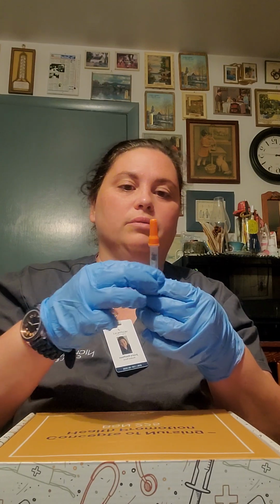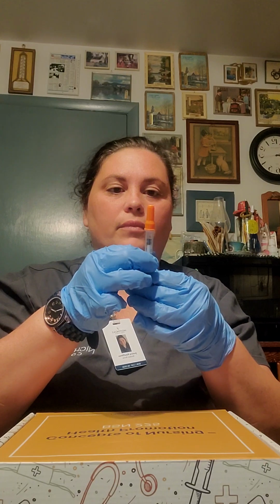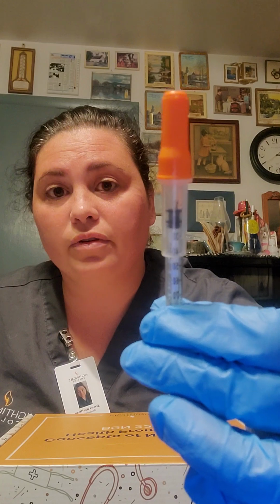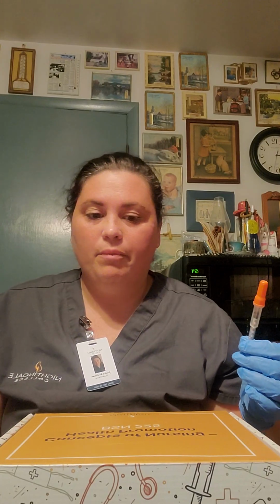Put the cap back on. Alright, and you can see I have 12 units in there, and I would verify this with my other nurse and with the MAR before giving my patient these 12 units of insulin.